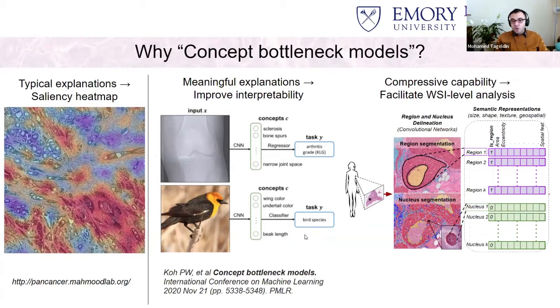So the advantage here is that it combines two things, right? It's the best of both worlds. You have the convolutional neural network doing the heavy lifting, and then you have a simple classifier doing the final prediction.